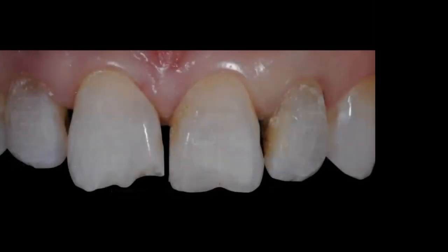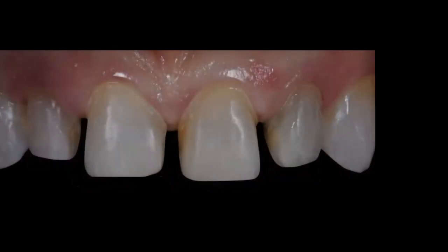After all depth-cutting guides come together and the prototype is removed, you can see that I have barely reduced or touched the enamel in some areas. I know I need more reduction — I want to add length, modify incisal edge position, reduce about one millimeter of the incisal edge, give the lab a finish line, go interproximally to close diastemas, and manage gingival contours.